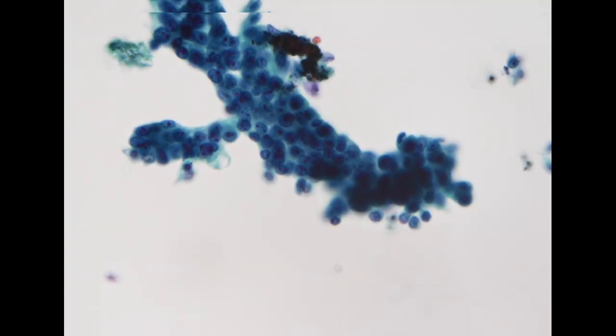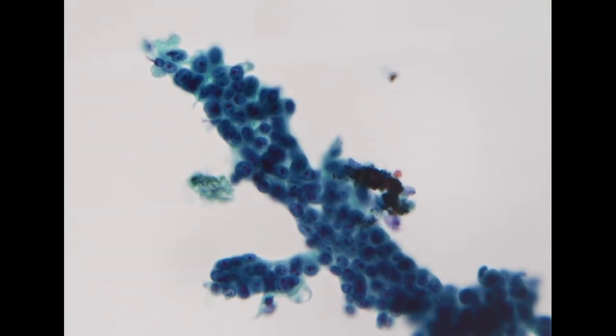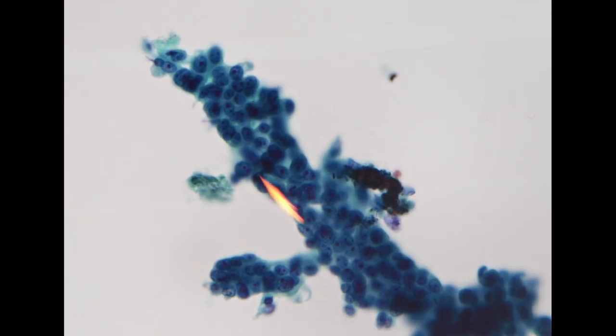So when we go to higher power, this is a classic cluster of adenocarcinoma, where the cells are polymorphic, with variation in size and shape, and most of them showing quite prominent nucleoli. Additionally, in the background, we do see prominent tumor necrosis as well.